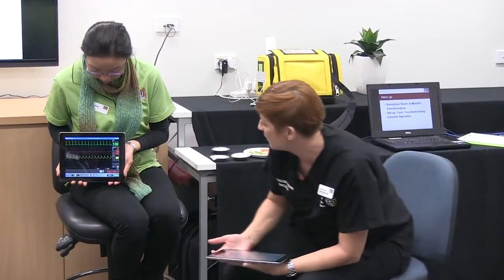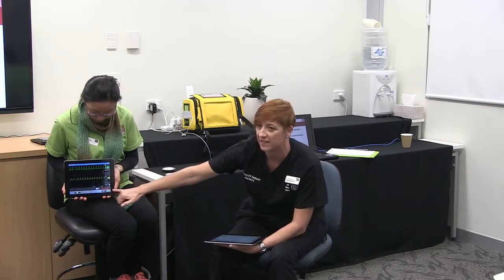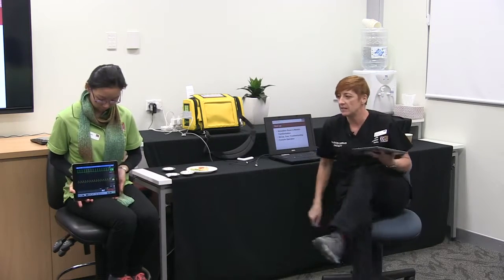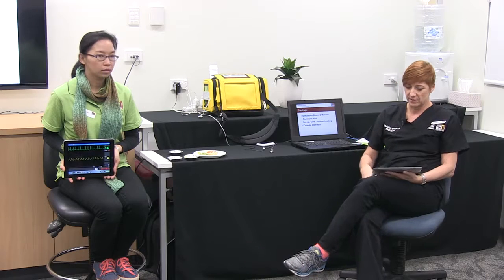You can get the arterial waveform on it or just get your numerical value. You can set this monitor up as a basic three-lead monitor. You can get art lines, CVP, and end-tidal CO2 on it. You can get your students used to looking at different waveforms, get them to talk about what they're looking for, and show them abnormal waveforms as well, so they know what sort of things to look for.